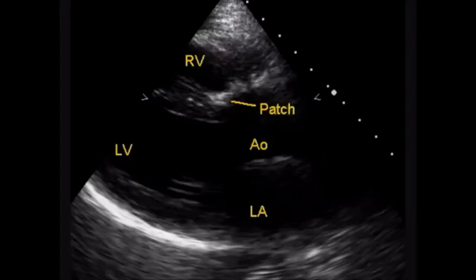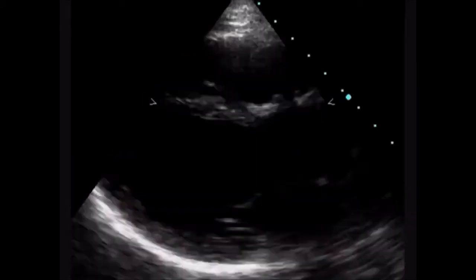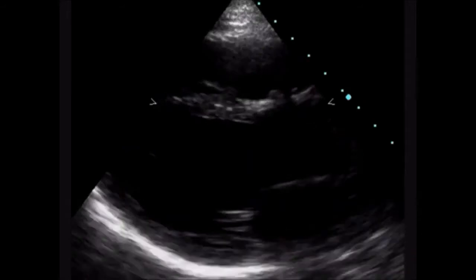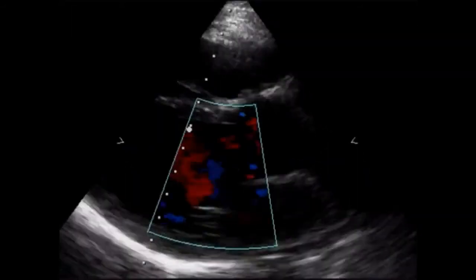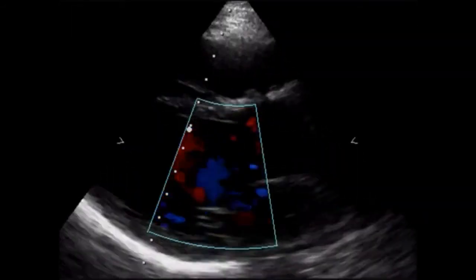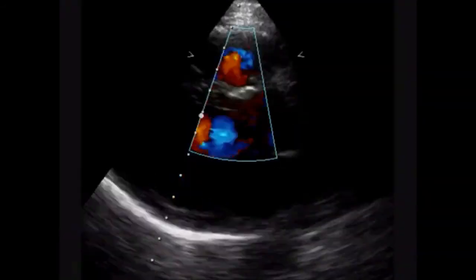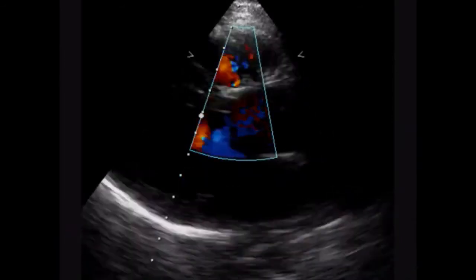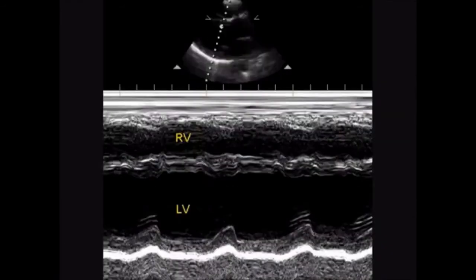Now we will see what happens after a repair of tetralogy of Fallot. You can see a dense patch in the sub-aortic region. There is no flow across the patch in this case, which means the repair has been complete. There is no residual ventricular septal defect.